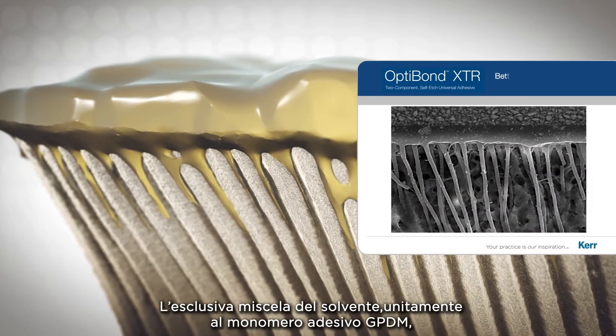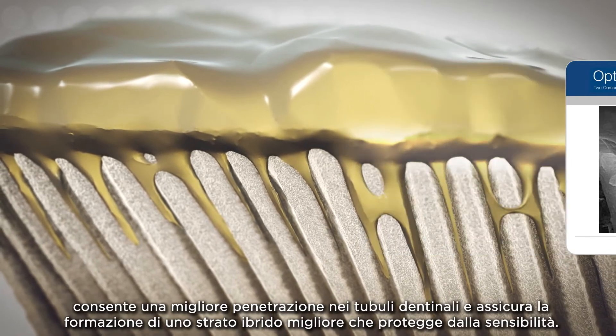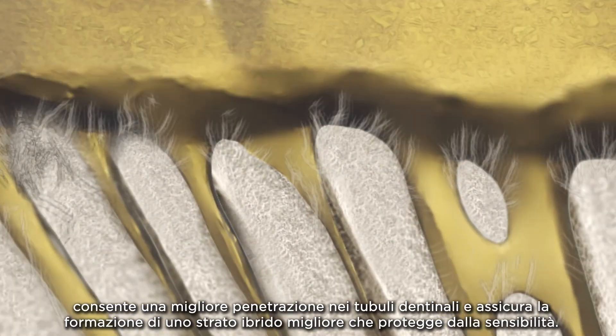The unique solvent blend along with the GPDM adhesive monomer enables better penetration of the dentinal tubules and ensures a better hybrid layer formation to protect against sensitivity.